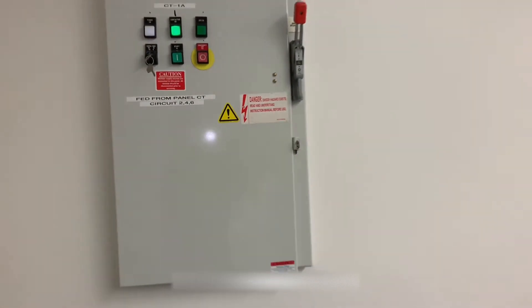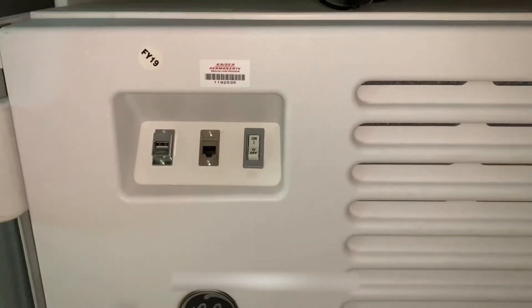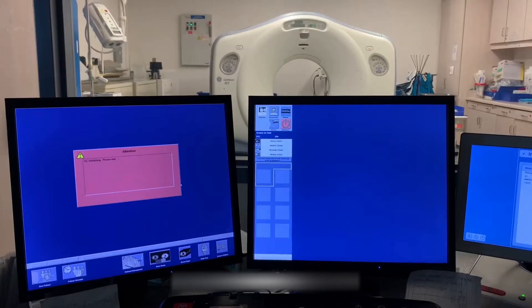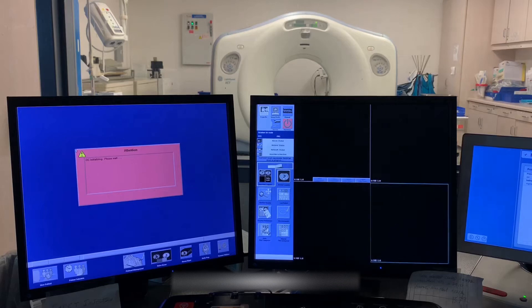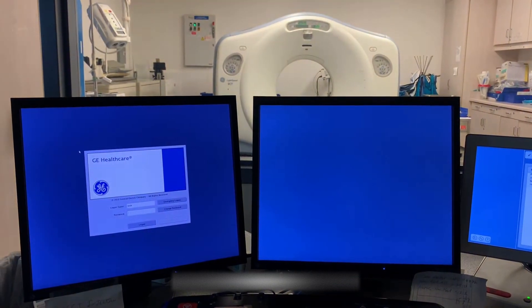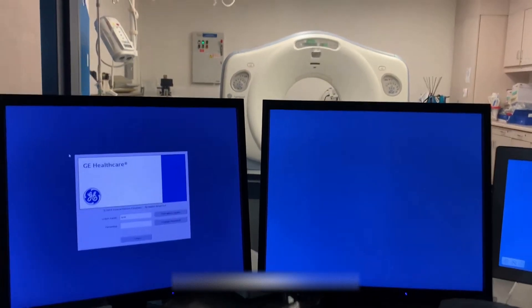Now you can head back to your operator console and flip the power switch to the on position. After about 6 minutes your system will boot into the login page. Enter appropriate user info to boot into applications.